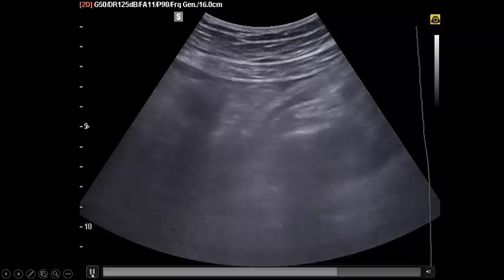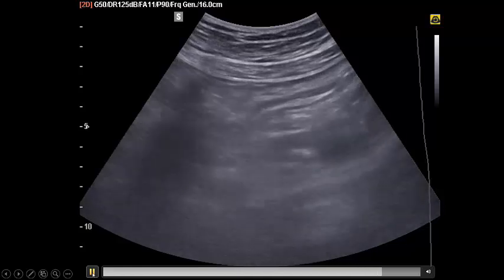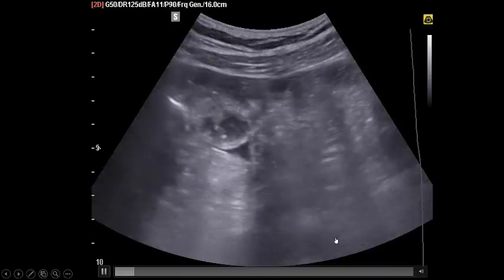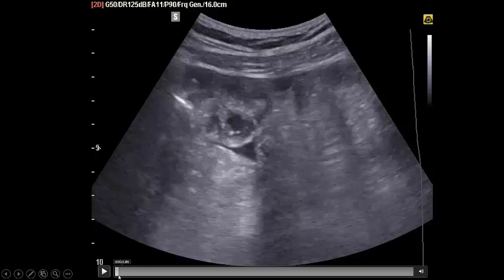So I have compressible intestine with no increase in diameter on the scale here, no increase in the wall thickness, and preserved gut signature or striation here. That means this gut is doing well in our patient. And this goes against mesenteric ischemia really. Good. Okay. This is another loop, you see.